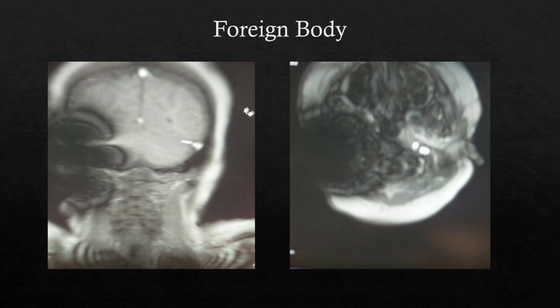So a couple of recent examples. This is, again, a localizer, very quick gradient echo scan. So the dark susceptibility artifact is evident in 2 planes. This patient had no indication of any previous surgery, and visually there was nothing on this patient before going on the scanner, so you'd be very concerned.